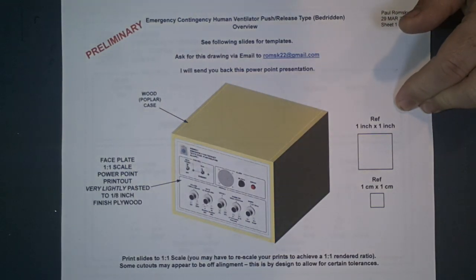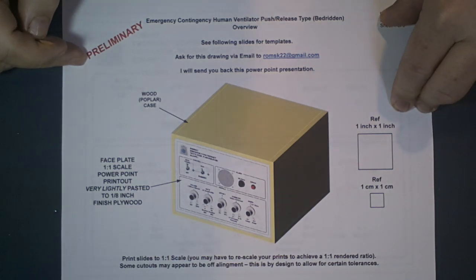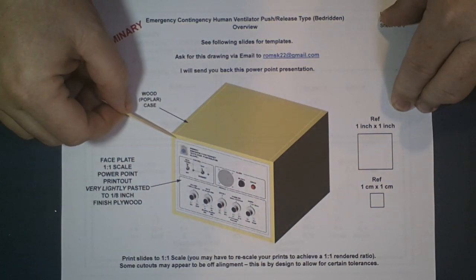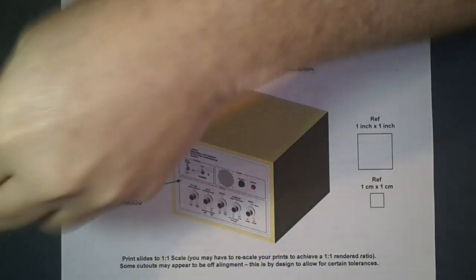This is a quick little video to show you how I'm going to build the box that contains the fan and the power supply and the Arduino Uno. What I've done is it's going to be printed out on a piece of very thin, like 1/8 inch, what I call finished plywood, something like this. You can see I printed out, this was just something I did really rough as a makeup reflector for my little home studio.